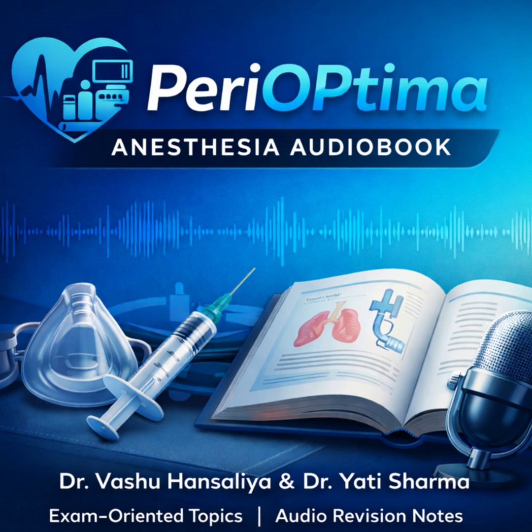The lag time. SpO2 drops late. If a patient stops breathing, say from an opioid overdose, their saturations might stay up for a minute or two because of their functional residual capacity, especially if they were pre-oxygenated. It monitors oxygenation, not ventilation. 10 points to Gryffindor. That is the crucial distinction. SpO2 tells you about oxygen in the blood. It does not tell you if the patient is moving air right now. For that, we need something else, which we'll get to.